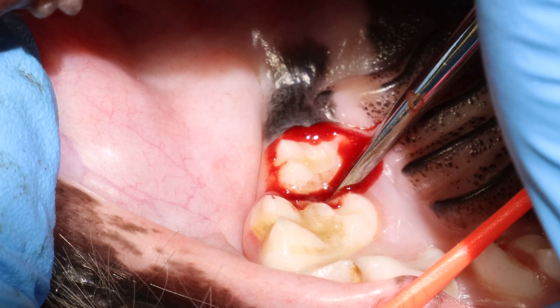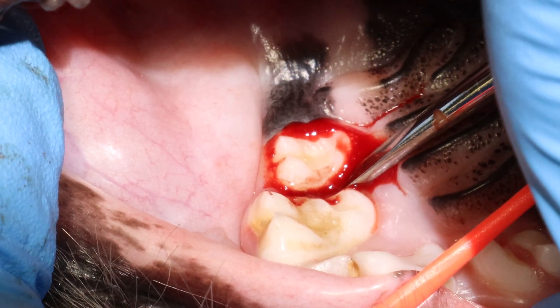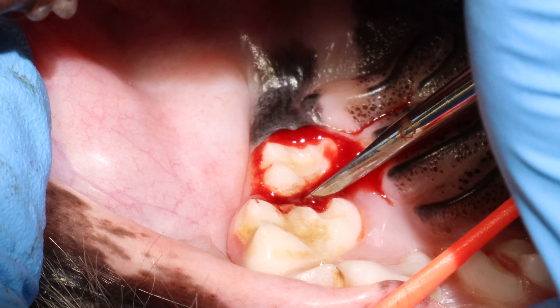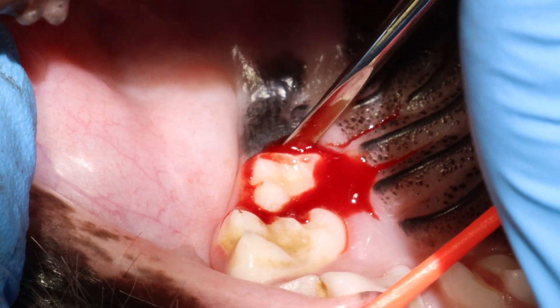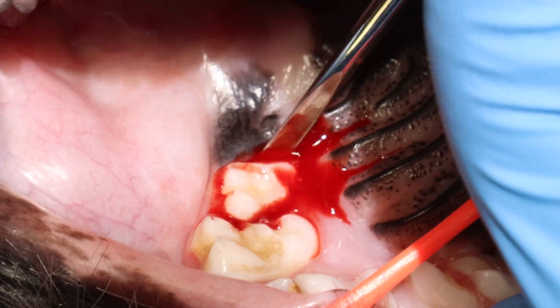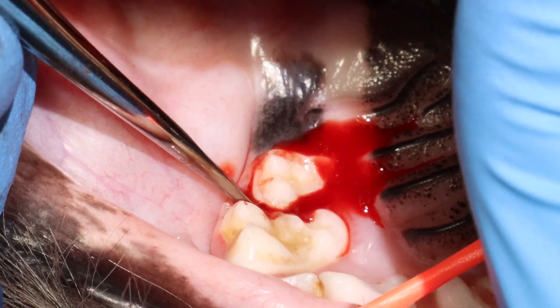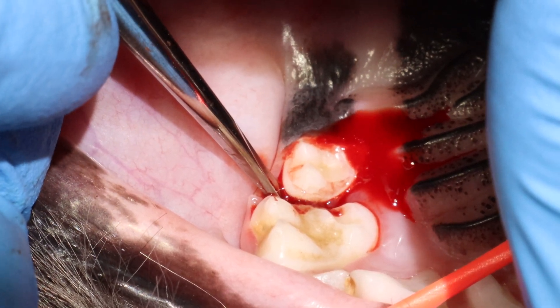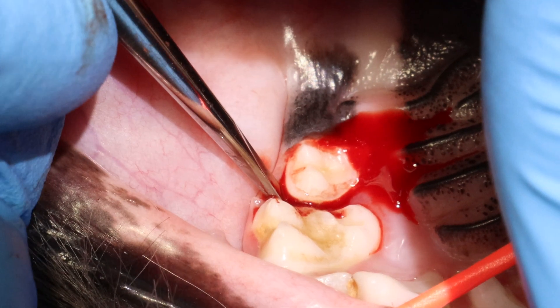If the tooth is moving, then you're in the correct position, and you have to count to 10 while you hold at gentle pressure — just two fingers of pressure. I'm just trying to move the whole tooth so all three roots get a little bit loose. I don't want to luxate too much, because I would risk fracturing the two buccal roots. I'm also applying a little bit of pressure on the buccal aspect.